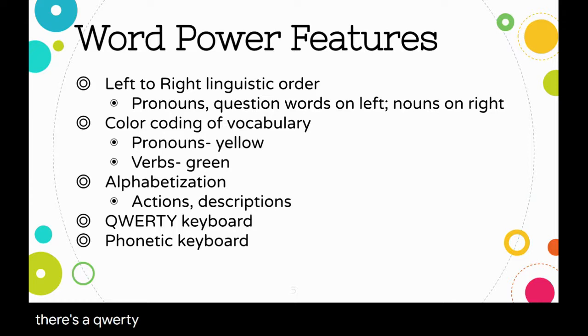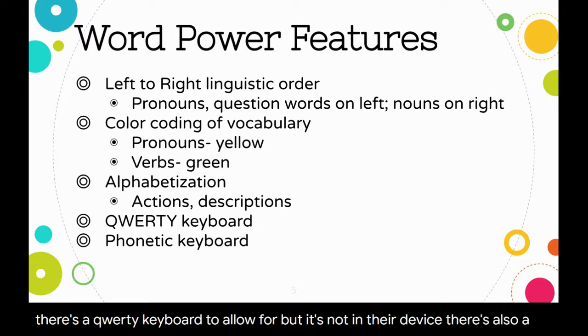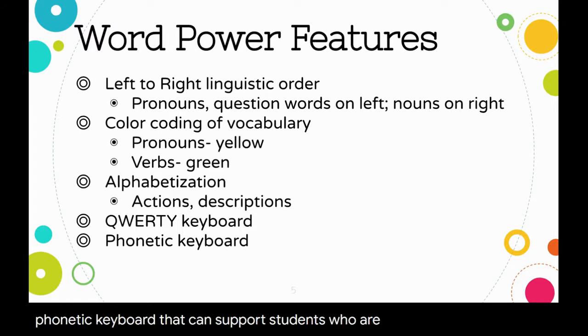There's a QWERTY keyboard to allow for typing of words when they may want to say something, but it's not in their device. There's also a phonetic keyboard that can support students who are learning how to read.